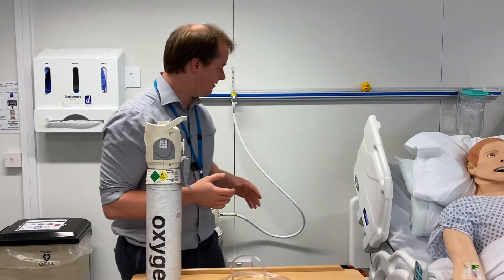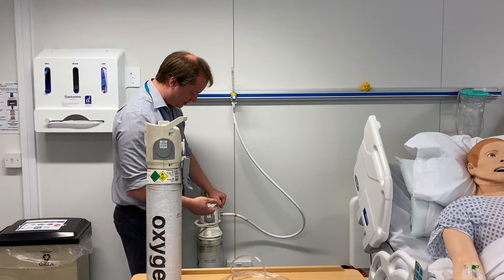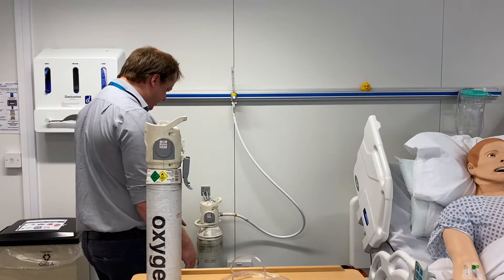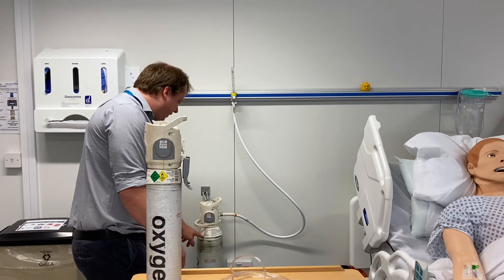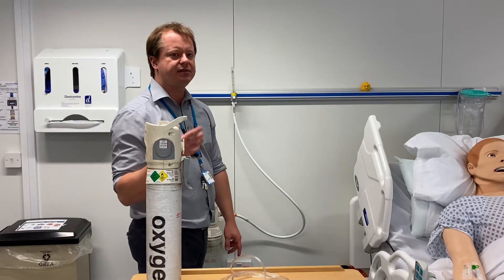Cylinders do come in other sizes. Here is a ZX oxygen cylinder, which is a bigger cylinder containing 3040 litres. That will last a bit longer, but not forever, so if you have patients on high flows of oxygen it's better to get them on the wall oxygen.